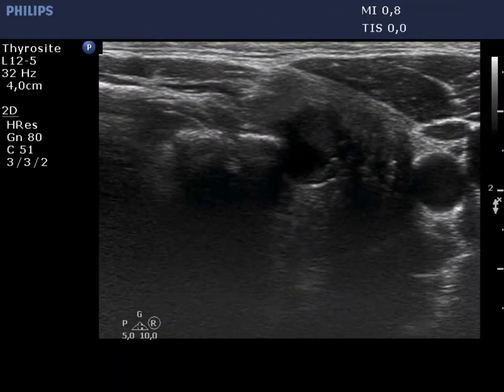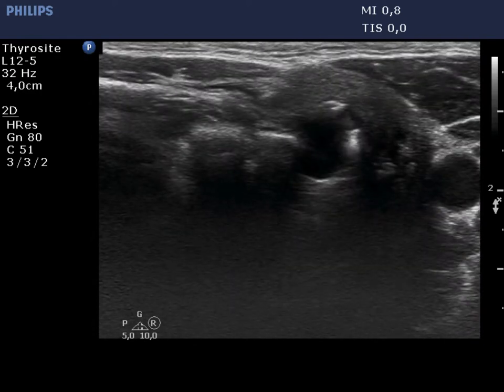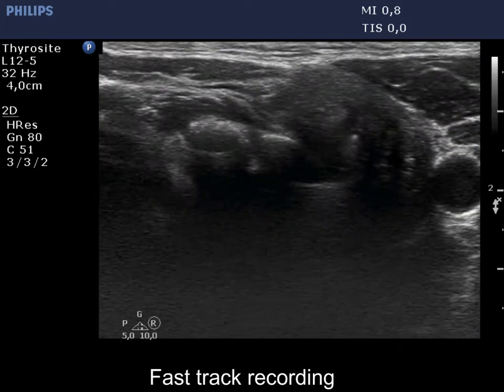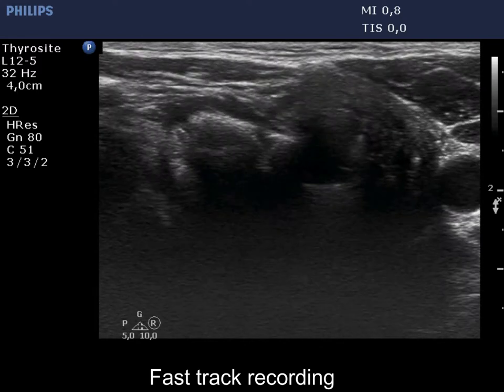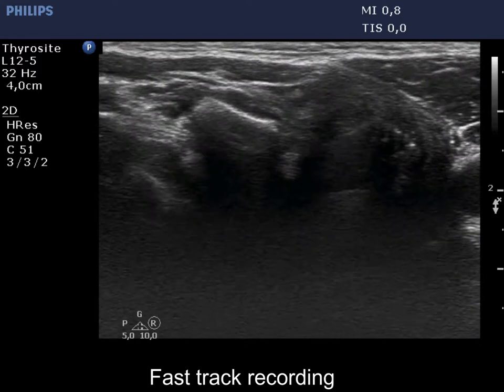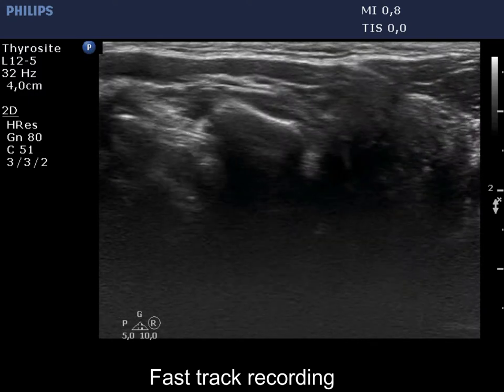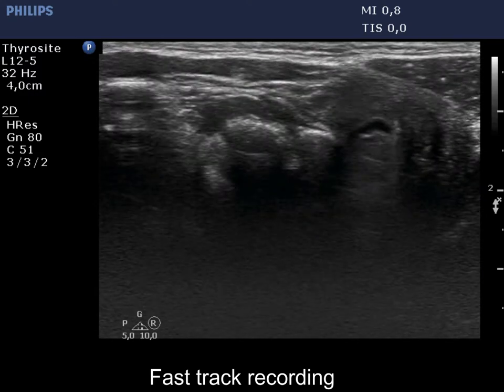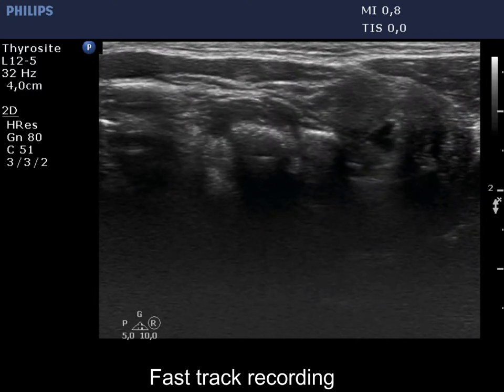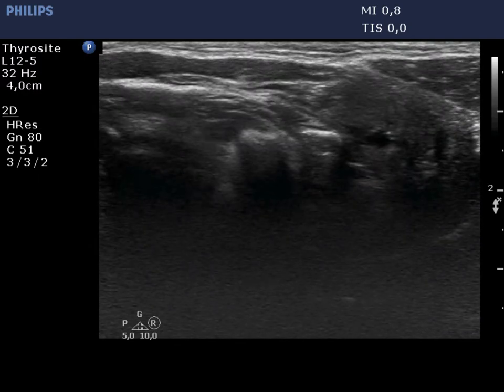The phase of alcohol administration: first we locate the needle in a safe position, and then start with the injection of ethanol. At advanced phases of sclerotherapy the nodules used to become rigid, as happened in this case. So I could inject only 0.5 milliliter ethanol.